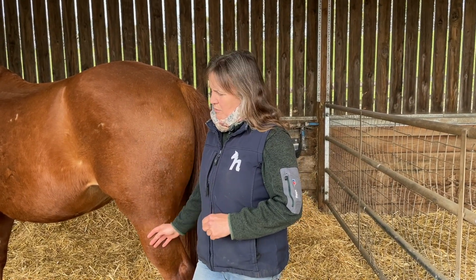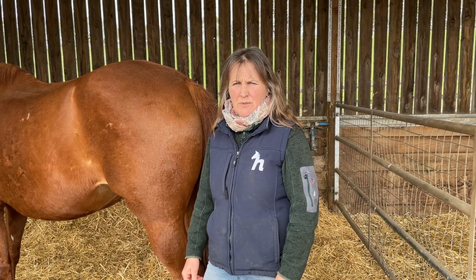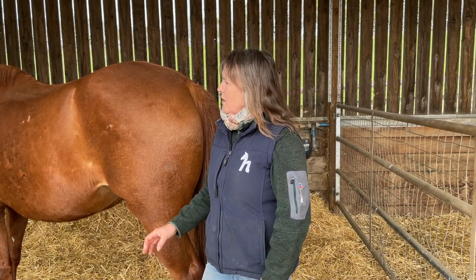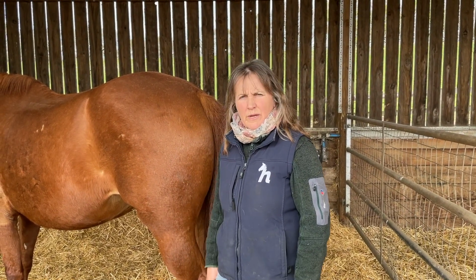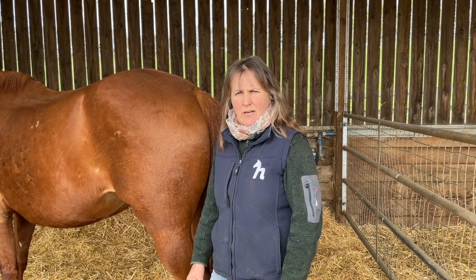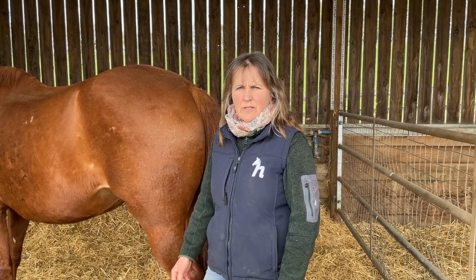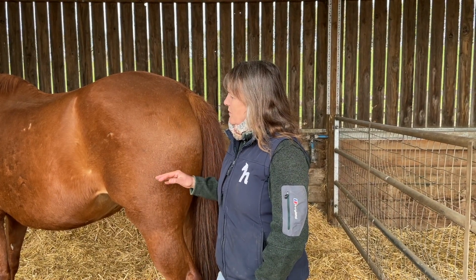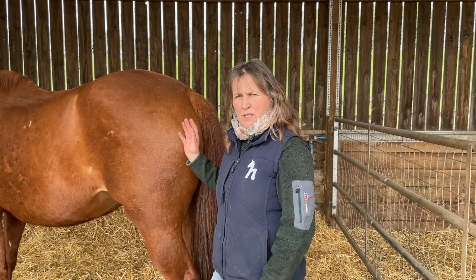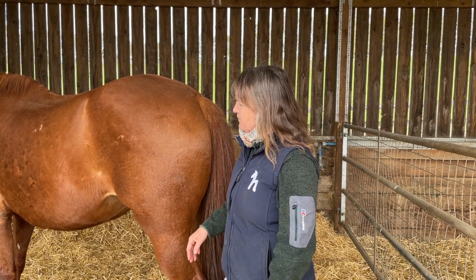Betty here has been on box rest for a couple of lameness issues, and we thought it's handy because female horses have slightly more going on under their tails than male horses, and some people do get a little bit confused, so we'll look at the absolute basics. So in terms of taking rectal temperature, we're going to be inserting a thermometer into her rectum.